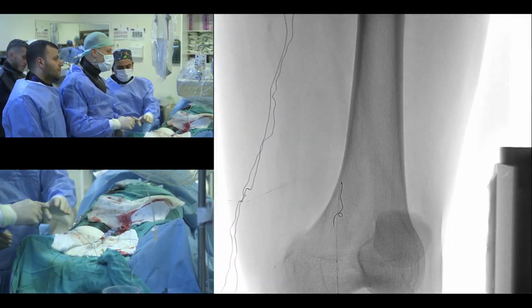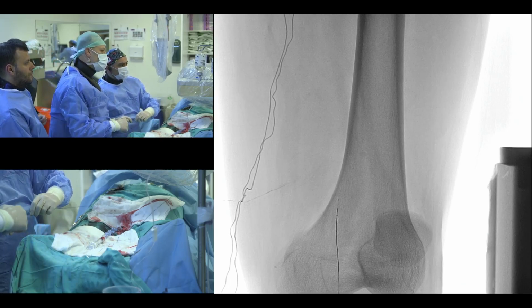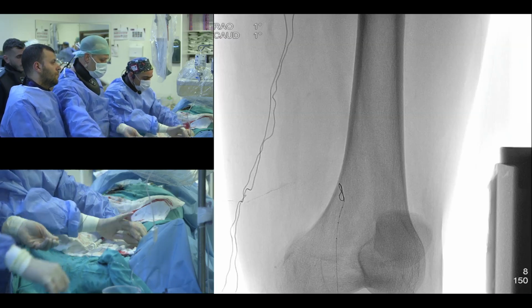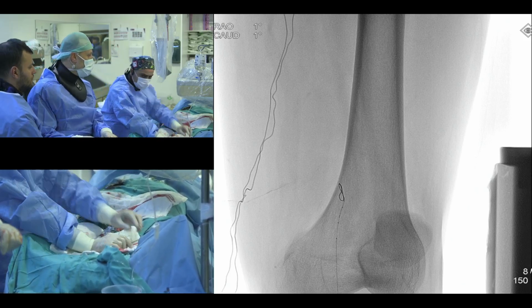Bekle. Dümeni biraz düzeltelim. Excellent. Biraz küçültelim. Belki burada büyük bir şeye geçmemiz gerekebilir. 35 şeyi büyütmemiz gerekebilir. Okey, büyütelim. Tel kalsın. Mikroyu çıkalım. Skop yani.